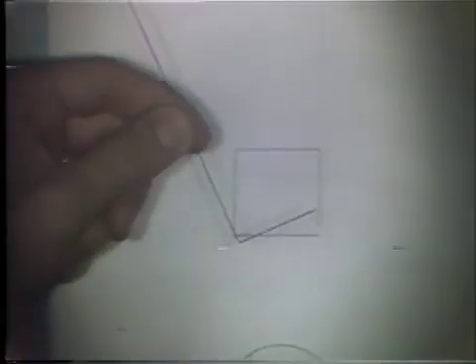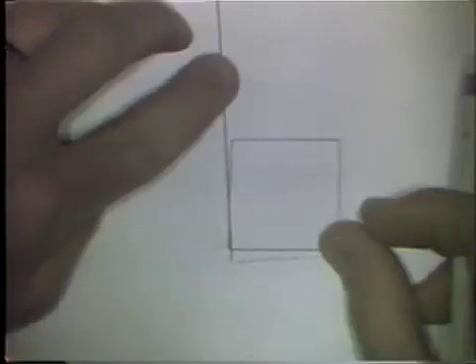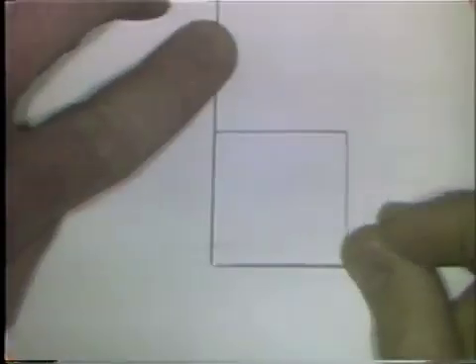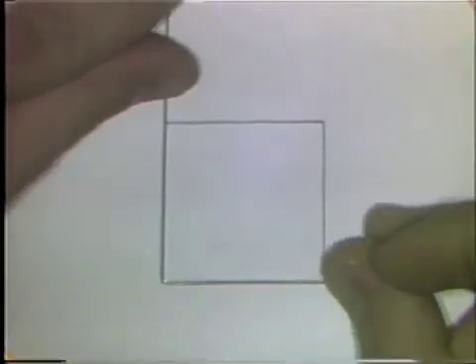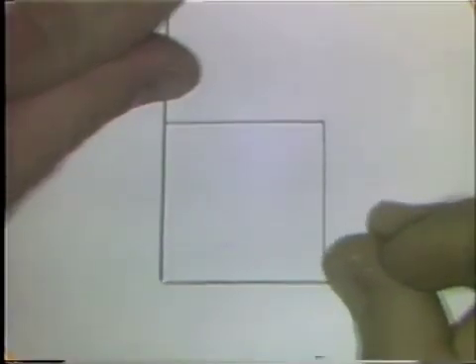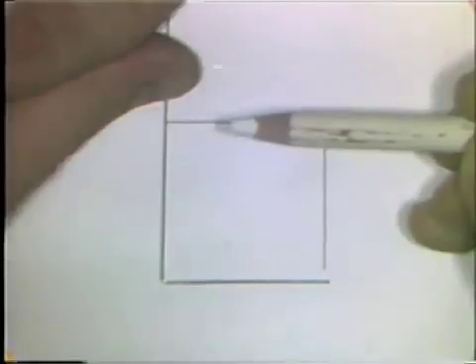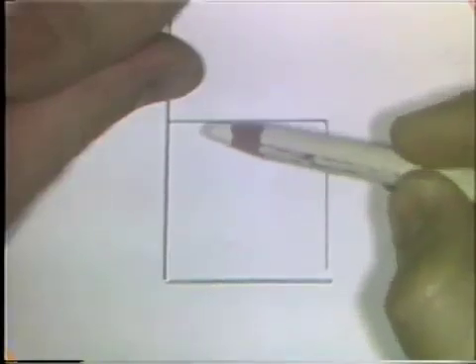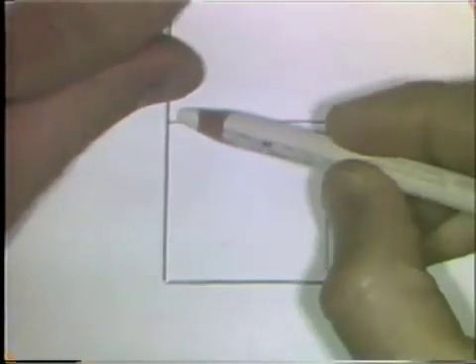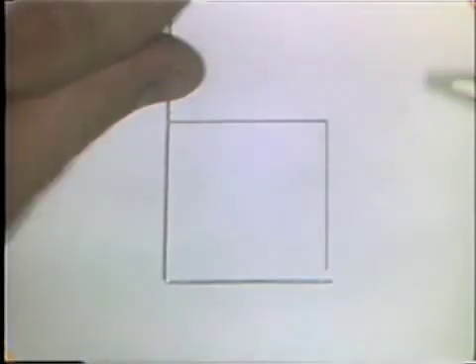To bend the first exercise, you start by making a 90-degree bend in a piece of 0.030 diameter stainless steel wire. You try the wire on the exercise pattern. The wire should completely cover the lines on the pattern. You position it and then mark the spot where the next bend should be started. You use a China marking pencil, wax pencil, or even a felt tip pen will work just fine. You mark the wire directly at the corner.